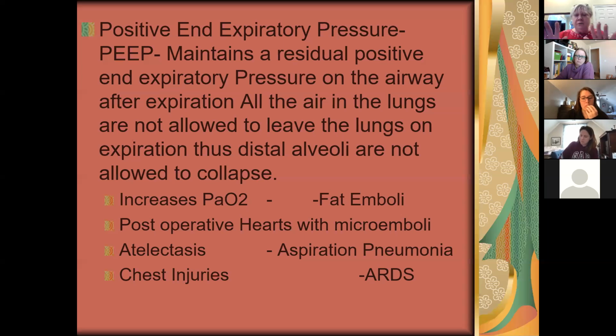Let's go on and let them keep the ET tube in. Let's let them do all their breathing on their own. But you know what? Let's give them just a little bit of pressure so that they don't have to work quite as hard. It's almost like giving them a little bit of oil for a squeaky door, or a little bit of oil so that when you go to lift the hood of your car, if there's not a lot of oil, that car hood can be a little bit heavy, but you oil that hood and that hood lifts a little easier. Well, they've got to open and close all those airways, and that pressure support just lets those airways open and close just a little bit easier so that their work of breathing isn't as hard.